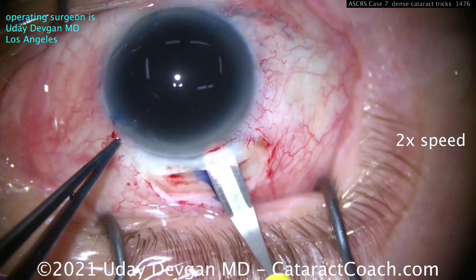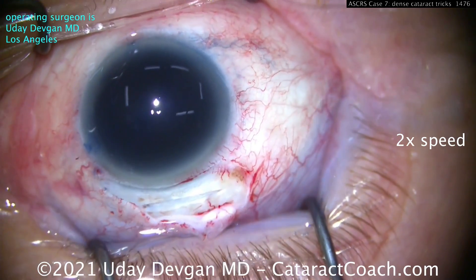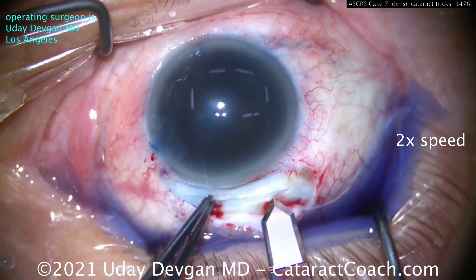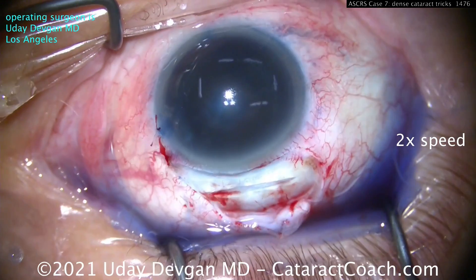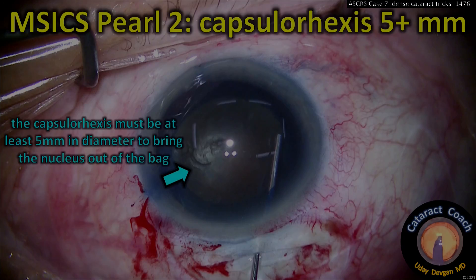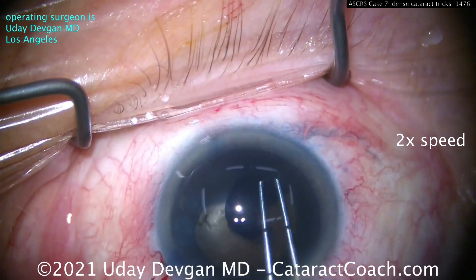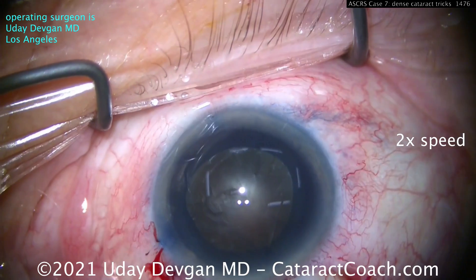Wash out that trypan blue dye. This is an absolutely brunescent cataract — very dense. And yes, I did this surgery in Beverly Hills; even fancy patients get these types of cataracts. Use the keratome to enter that same tunnel. Pearl 2: make a big rhexis, please — at least five millimeters. You have to bring the nucleus up through the rhexis, so don't have a tiny rhexis. We've got a nice, generous rhexis of at least five millimeters — that looks beautiful. When you do the hydrodissection, you may not see the fluid wave because the lens is so opaque, so do a little at a time just to get that nucleus out of the capsular bag.